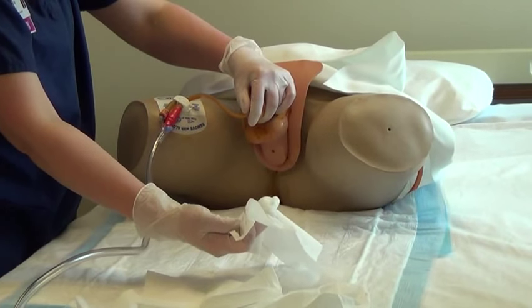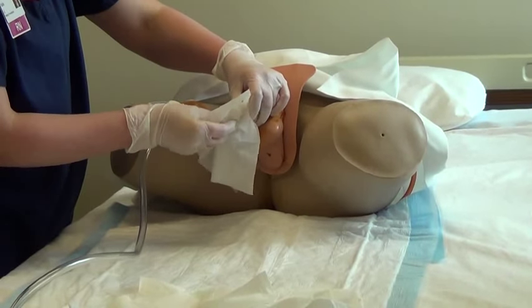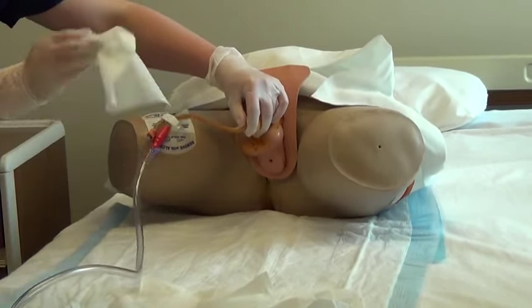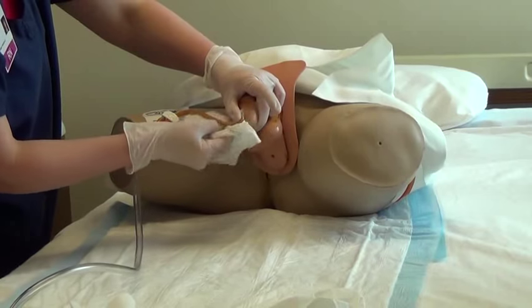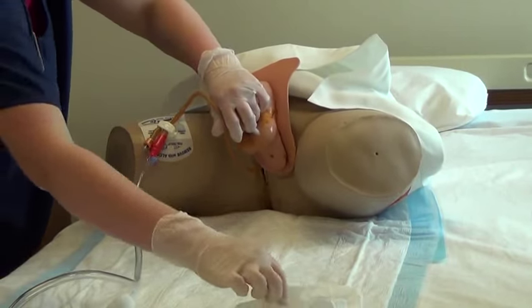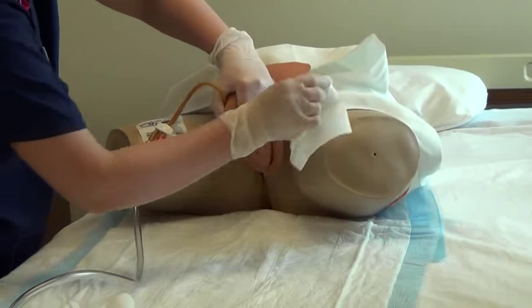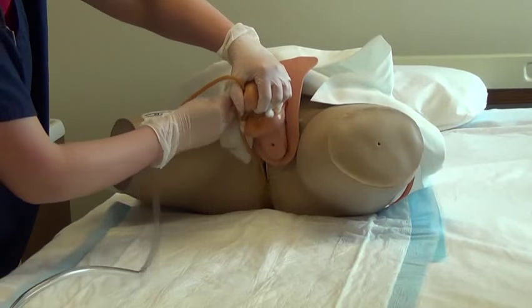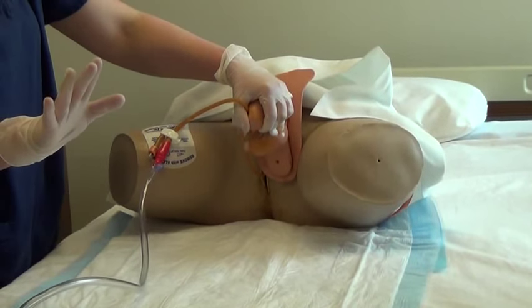For males, with your first wipe and starting at the meatal junction, gently cleanse the first 1 to 2 inches of the Foley, then stabilize the Foley with your non-dominant hand while cleaning the remainder of the catheter to the bifurcation. With your second wipe, clean the meatus and the glans. Use your third wipe to cleanse the shaft. The fourth wipe is used to clean the inner thigh away from you in a downward motion. The fifth wipe is used to clean the inner thigh toward you in a downward motion. Your Foley insertion and subsequent Foley care is officially complete.